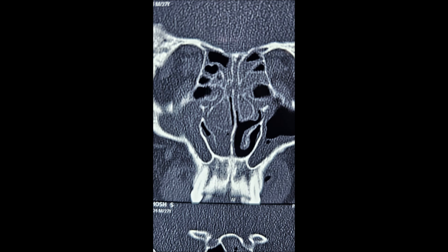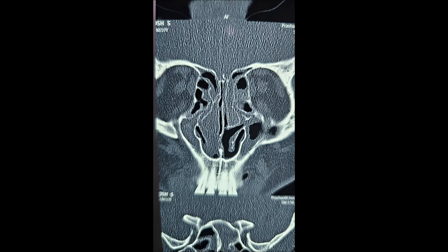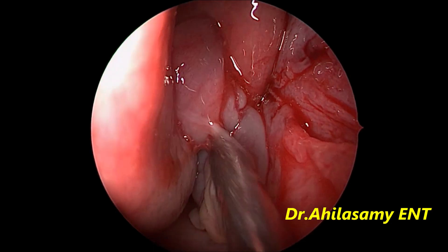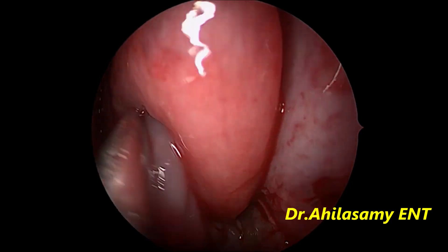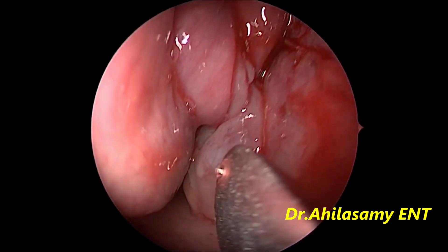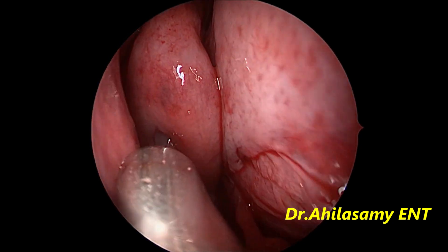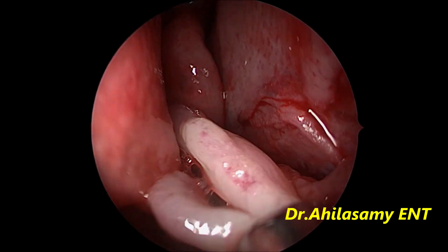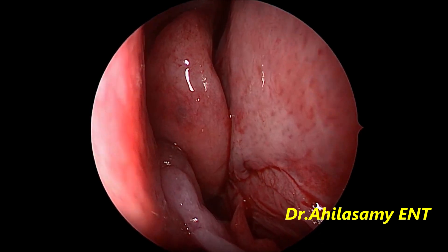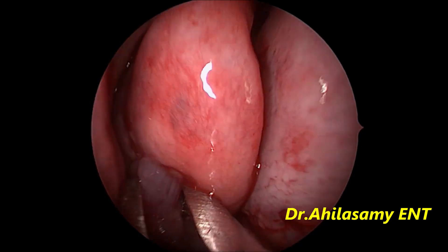This is actually a bilateral AFS case taken for bilateral functional surgery, but I am showing only the very rare phenomenon of a polyp coming out of the right concha bullosa cavity. Usually a polyp does not arise from the right middle turbinate. You can see the polyp coming through the accessory ostium of the right concha bullosa. Usually the concha bullosa has its normal ostium on the posterior part. You can clearly see the polyp coming out — it is a concha nasal polyp coming through this accessory ostium, the abnormal accessory ostium of the right concha bullosa.